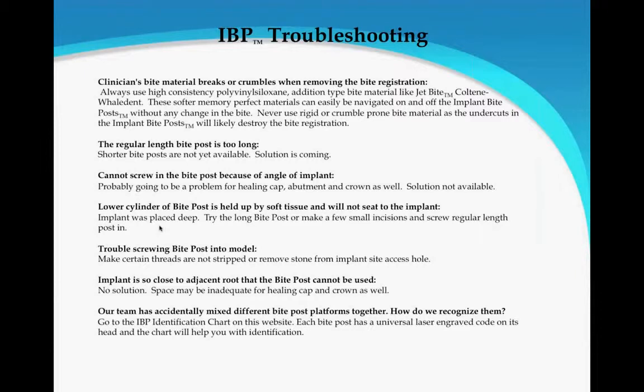Trouble screwing the bite post into the model. We went through that. Sometimes the stone is in the way. There's nothing sacred about that hole, you lab guys. I know most of you know that, but every once in a while a lab guy calls me on troubleshooting and tells me the bite post doesn't work because it won't screw in. The implant is so close to the adjacent root the bite post cannot be used. I don't have a solution for that either. It's too close.